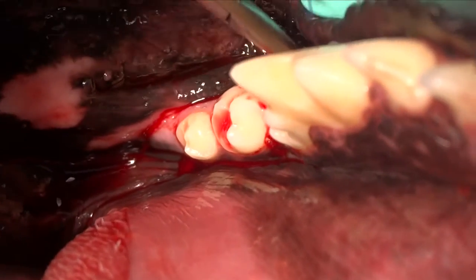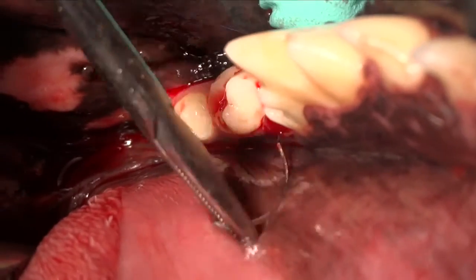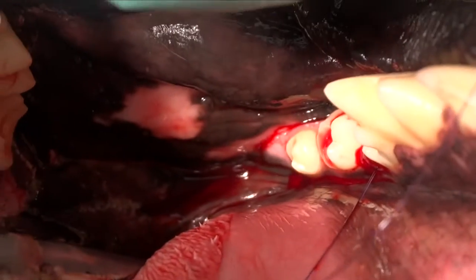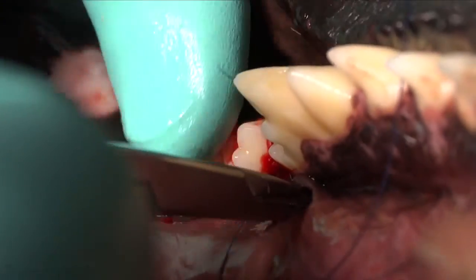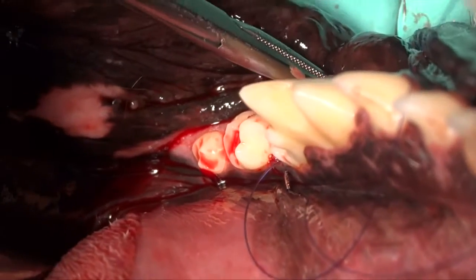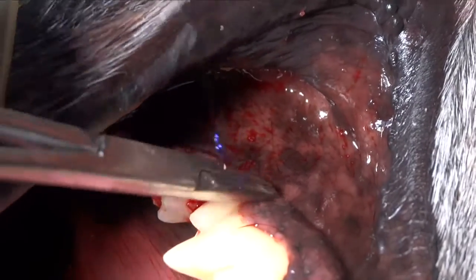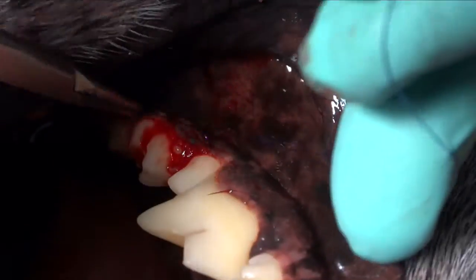What we're doing here is placing a horizontal or vertical mattress suture pattern, where we go from vestibular to lingual and back lingual to vestibular and tie, to keep that bone graft in the defect and re-appose the gingiva up to the tooth. You can see how we're doing that using the papilla — a horizontal mattress pattern closing that to oppose the papilla up against the interdental space between those two teeth.